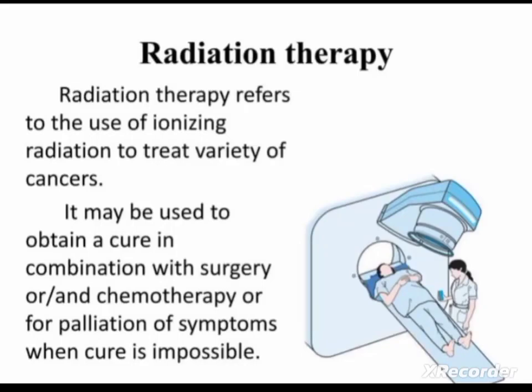Radiation therapy. Radiation therapy refers to the use of ionizing radiation to treat a variety of cancers. It may be used to obtain a cure in combination with surgery or chemotherapy, or for palliation of symptoms when cure is impossible.